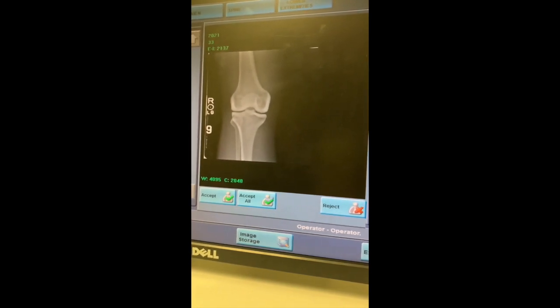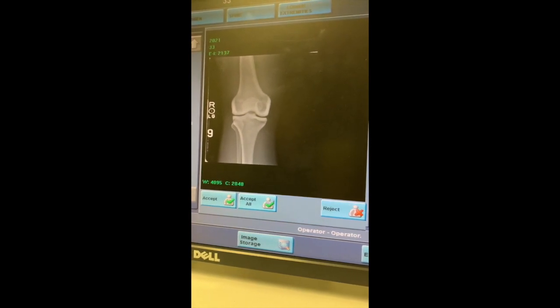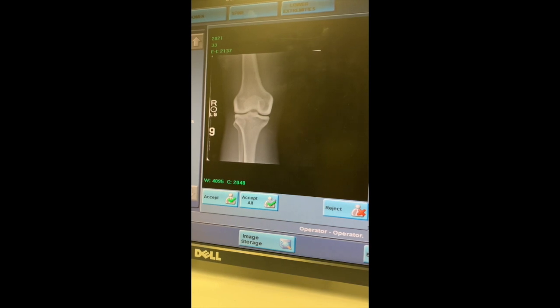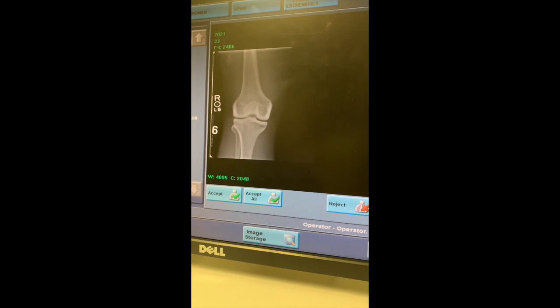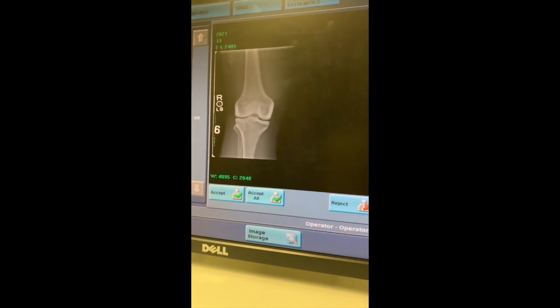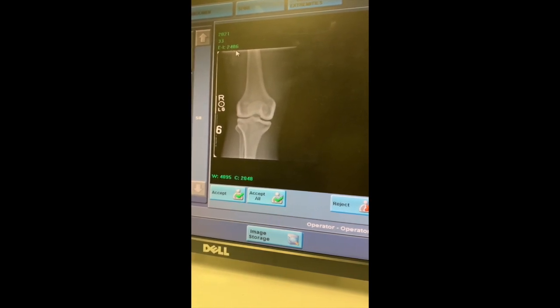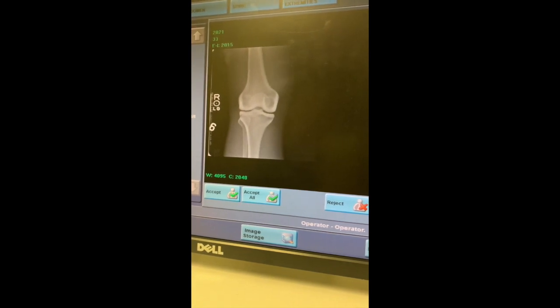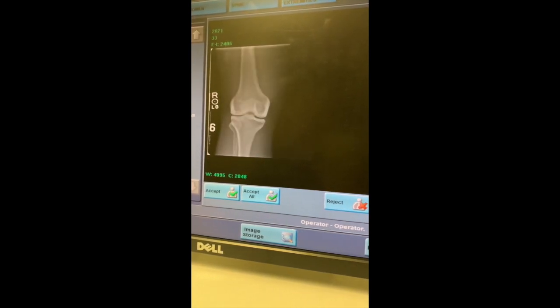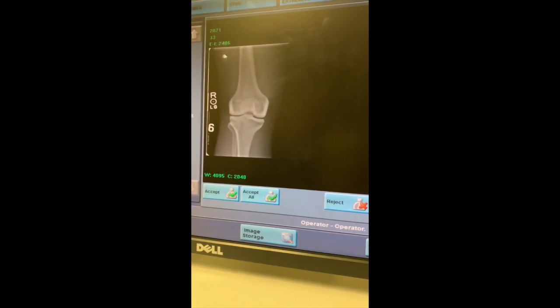Second one is 75 kVp. We're still at 2137, but the image isn't changing drastically. And then the third one doesn't show up without the step wedge, of course, and this one was done at 90 kVp at 5 mAs, and the exposure index is 2406. So you look at this one at 75 or at 70, and then you go to 90, it's not that big of a change, right? Even though kVp does change, the numbers have changed significantly, but not the images.